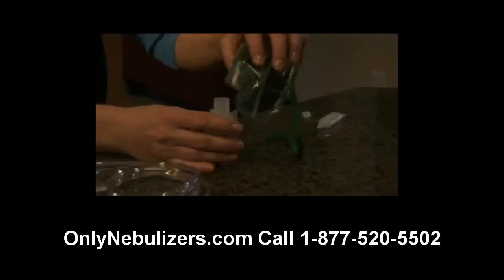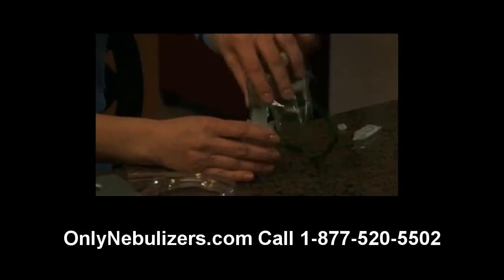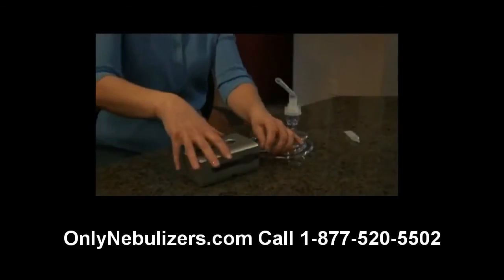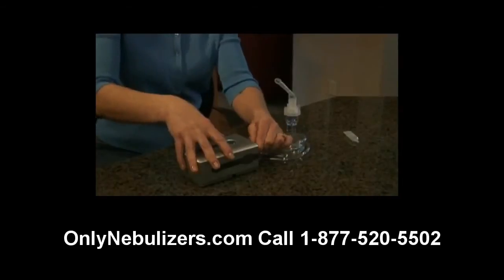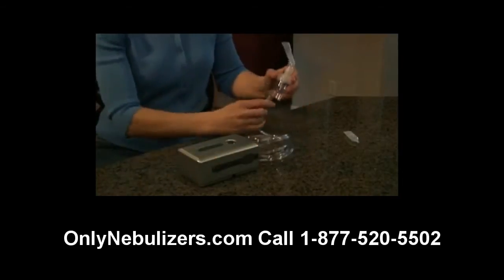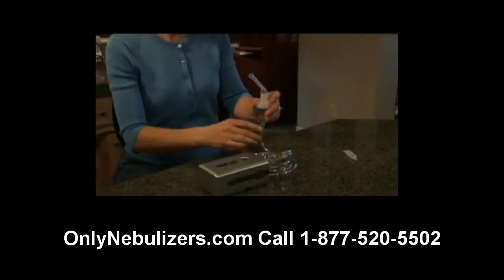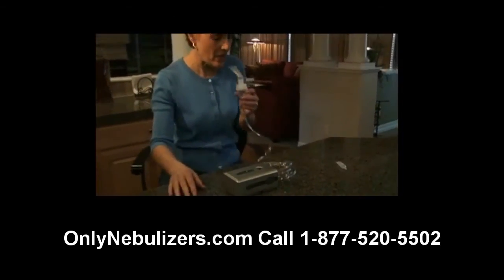If you're using an aerosol mask, place the mask adapter directly into the top of the nebulizer cap. Finally, attach the tubing to the nebulizer air inlet connector. You're now ready to begin treatment by turning the compressor's power switch on and placing the mouthpiece between your teeth.